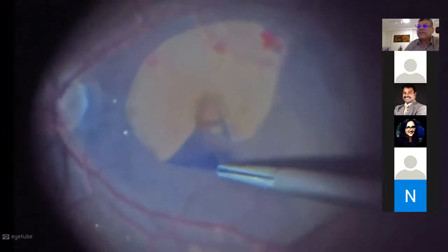It's very important to get the most of the membrane — get the bulk of it and keep peeling. If you have this round tubular shape of the peel, you should leave it where you can see it. You should not raise the flow or increase the bottle height — meaning increasing the intraocular pressure — because then it's going to escape elsewhere.